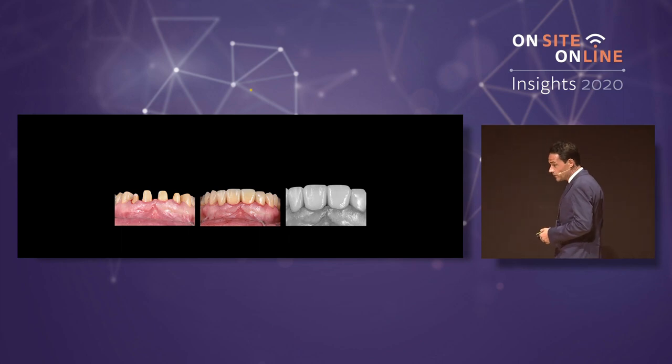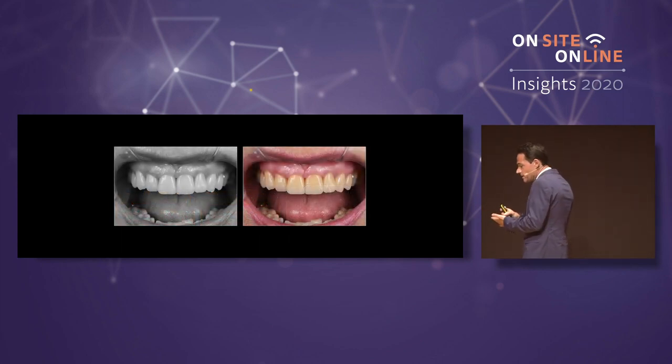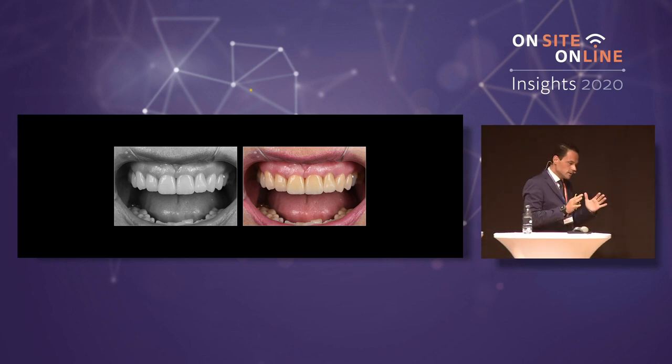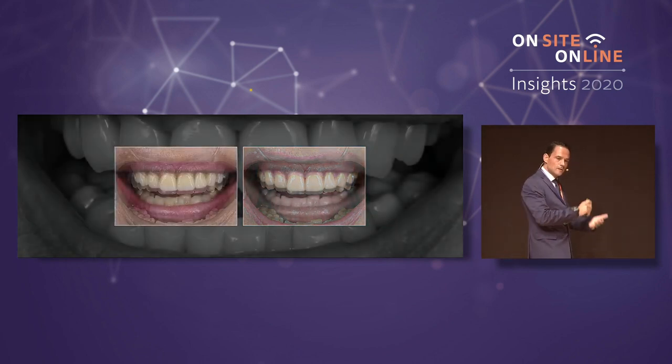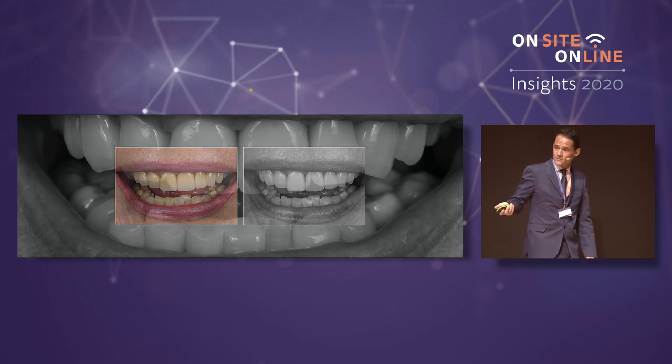I love working with monolithic materials. Less is more, because with some staining techniques, I stratify the stains of the porcelain. With the microscope, I dedicate a lot of time to painting these monolithic veneers, these monolithic crowns, and this is the result.